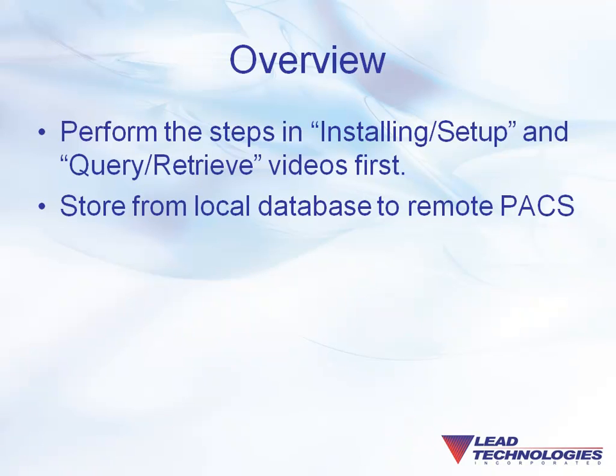Before viewing, ensure you have performed the steps detailed in the medical workstation videos Installing Setup and Query and Retrieve.